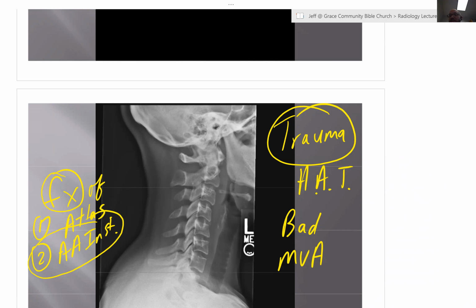Great case. So follow-up is to get an MRI, high field, none of this 0.3 Tesla junk. At least 1.5 Tesla, and I always tell the imaging center, hey, I want upper cervical trauma sequences. I want you to slice through those apical and alar ligaments with a high magnet, because I think they're gone because of what I see on plain film. Yeah, go ahead and get the rest of the cervical spine, but I want upper cervical protocol, I call it, because of what I see on plain film. So good call, guys. You guys are 2 for 2.